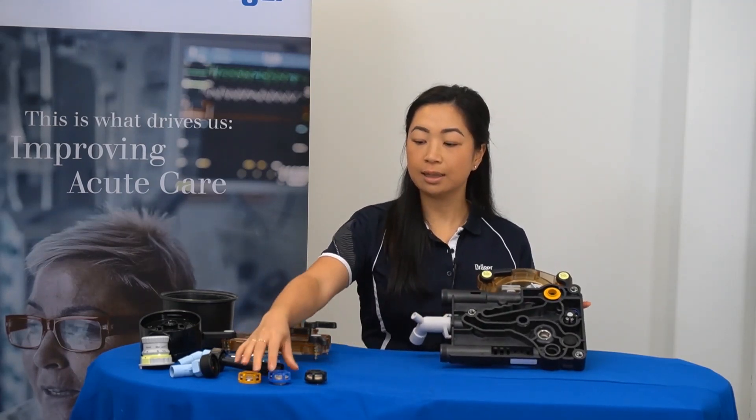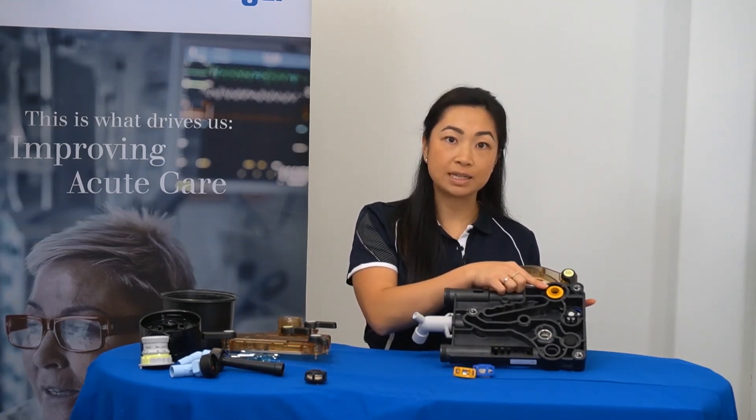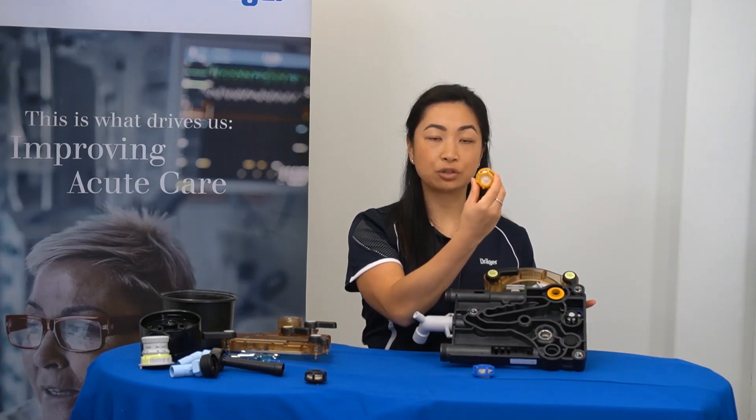Then, returning the expiratory and inspiratory valves to their original position. The inspiratory valve is colour coded to help locate its position. You'll find two notches on the inspiratory valve at roughly 10 and 2.